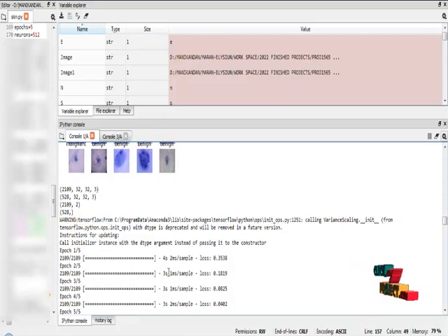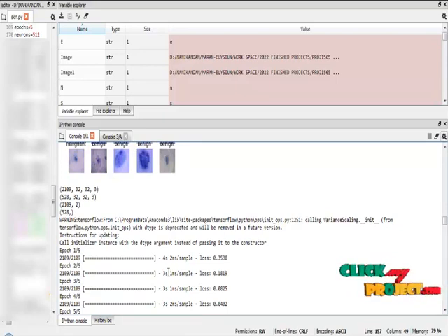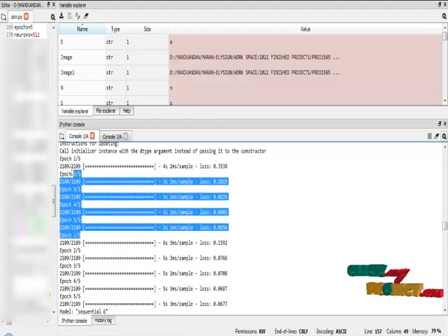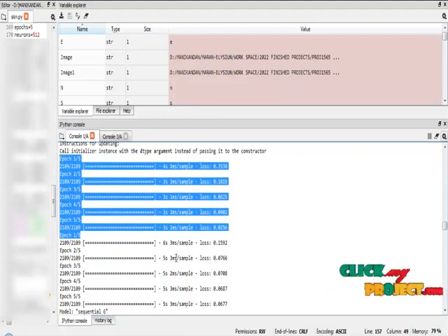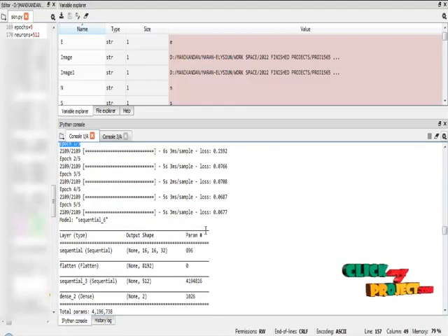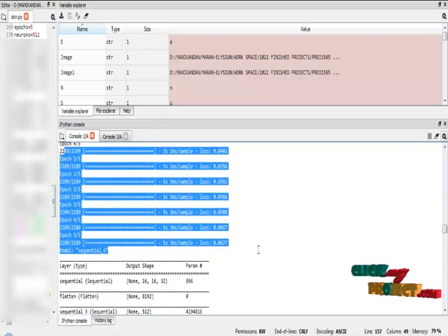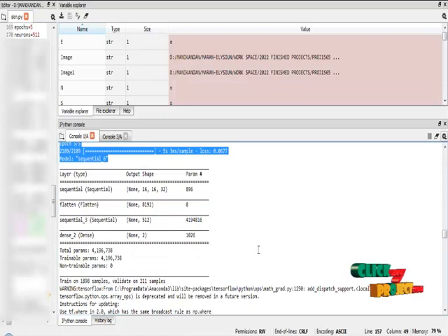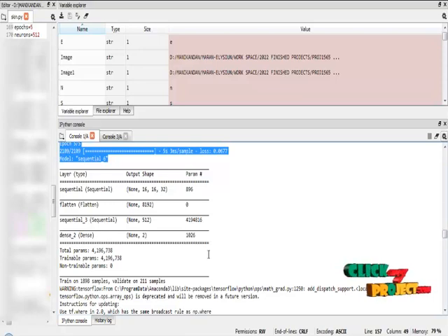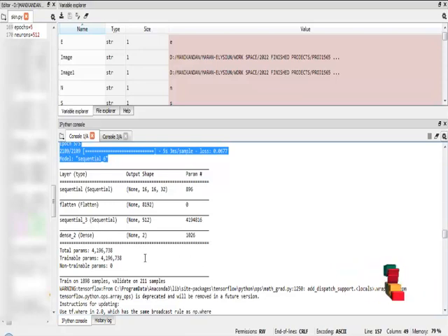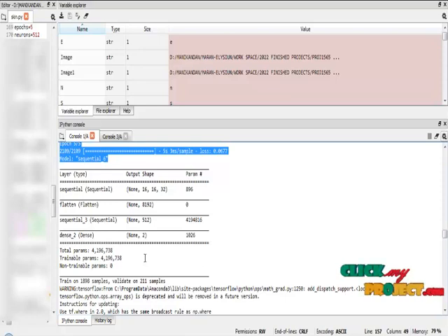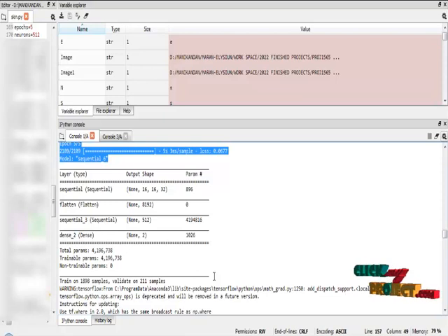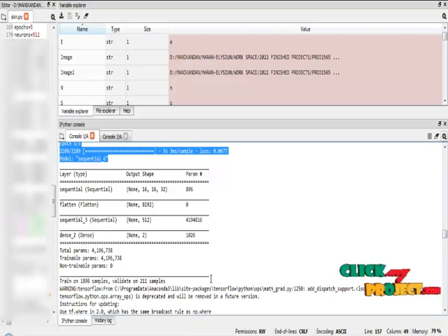After that, I have to apply the Sparse Stack Autoencoder and Decoder with Convolutional Neural Network algorithm. First, it will implement the encoding method. After that, it will apply the decoding method. After execution of encoding and decoding method, the Convolutional Neural Network algorithm extracts the parameters from our input data. It will extract the parameters of 4,196,738. Overall, all the parameters are trainable parameters. It will take the data and analyze the images based on the parameters of the CNN algorithm.